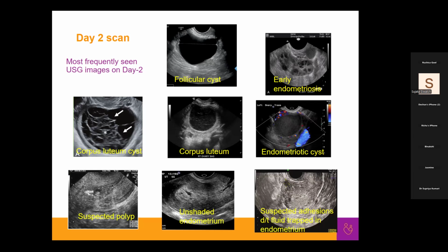For the sake of convenience, we take the diameter, because many of us are used to doing ultrasound for a very long practice, so that can give us some idea. Before freezing the picture on one frame, we scan the entire ovary, then we fix a frame and count the AFC. But ideally it should be the ovarian volume that gives us a better picture.